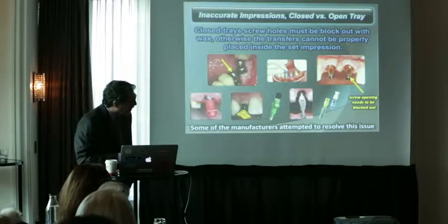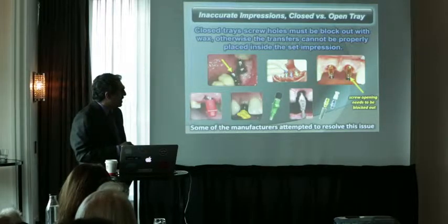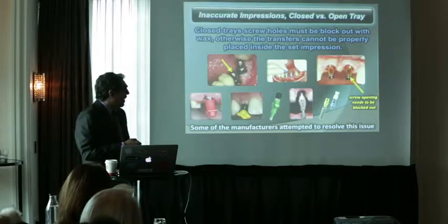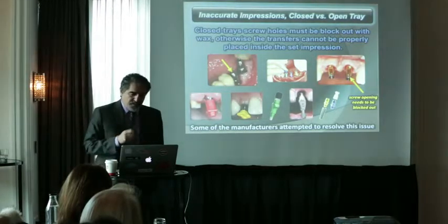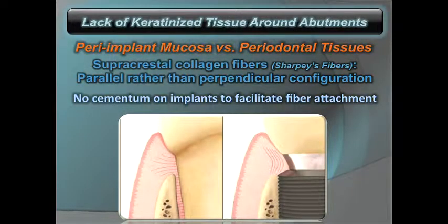You have to make sure that you fill that hole with the wax. And also in Hiossen, as you can see, there's a big hole here, and it's not going to go in if you don't cover that spot with wax. So that will help, and that's a very important little issue that can cause some complications later.